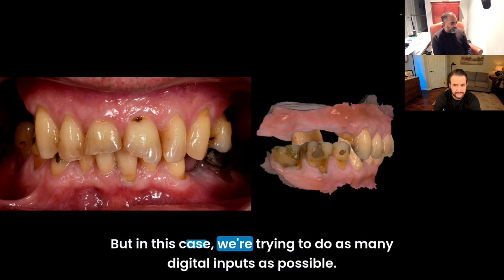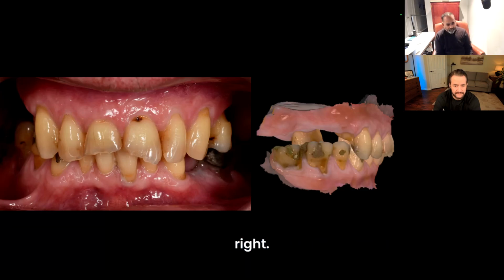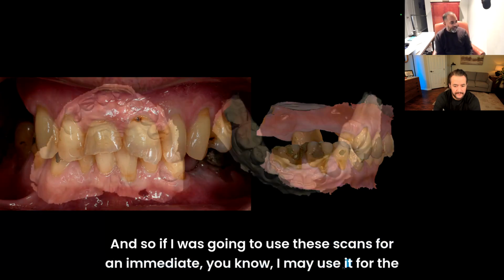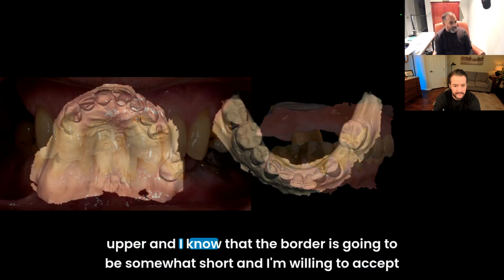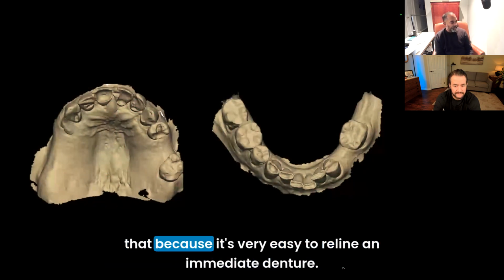But in this case, we're trying to do as many digital inputs as possible. So this is just a basic upper and lower scan with a bite on the left and a bite on the right. If I was going to use these scans for an immediate, I may use it for the upper, and I know that the border is going to be somewhat short, and I'm willing to accept that because it's very easy to reline an immediate denture.